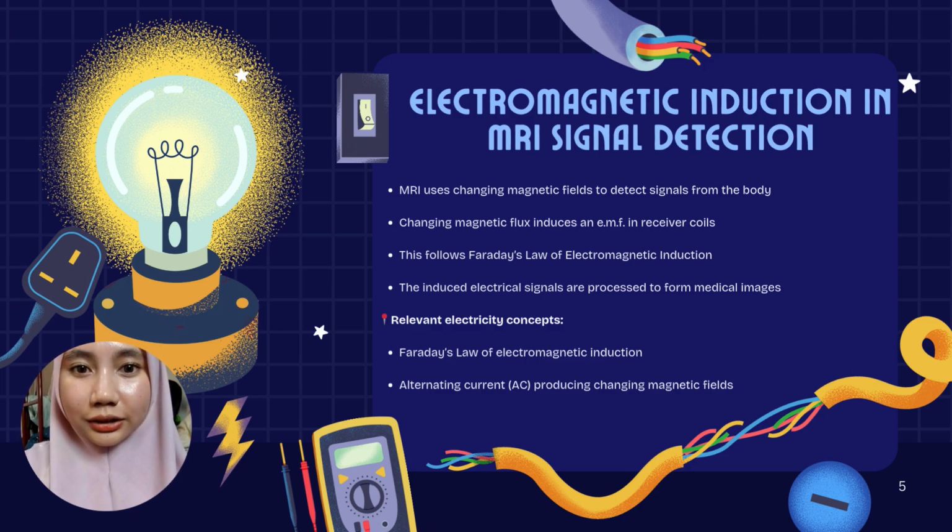These induced electrical signals are detected by the coils and sent to a computer. The computer then processes the signal to form detailed images of the internal organs. Therefore, electromagnetic induction is an important electricity concept that allows the MRI machine to detect signals and convert them into medical images.